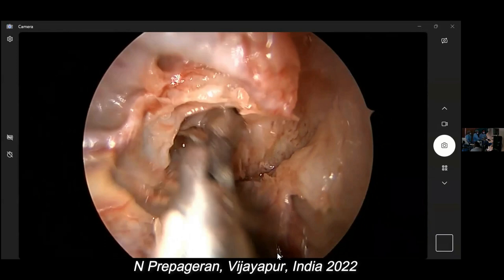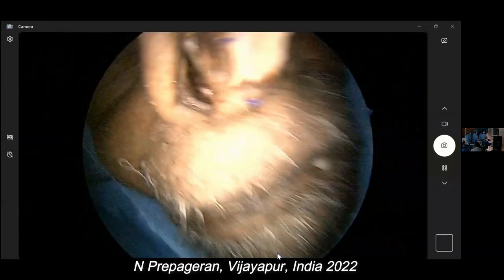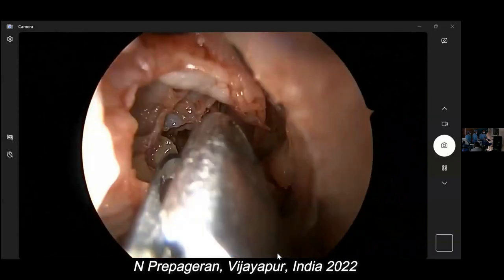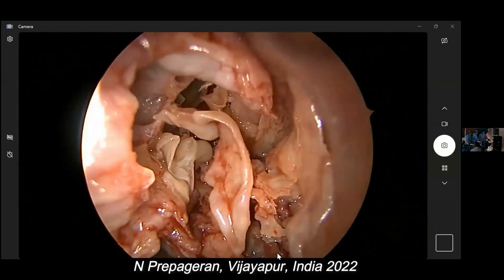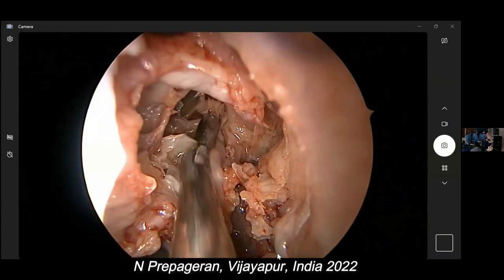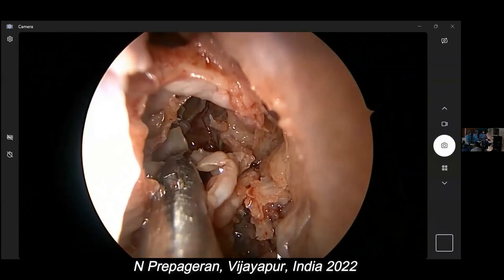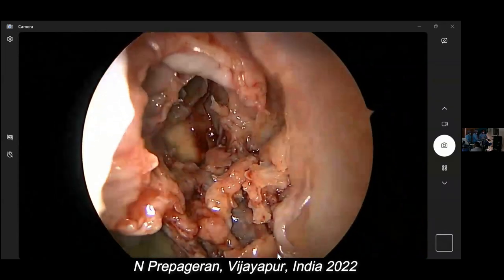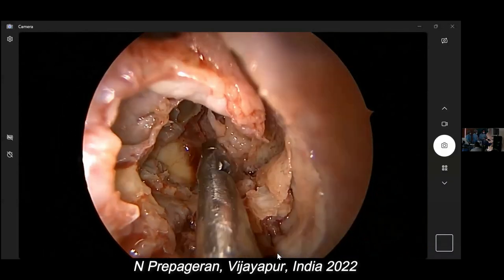So are we changing the direction of the scope from gate three to gate four? No, it's a 0-degree scope all the while. Yeah, and that means turning the endoscope a little medially. No, it's the same place. Okay, sir. Does it look as if I changed? No, I don't know. I'm just asking. No, I didn't change.